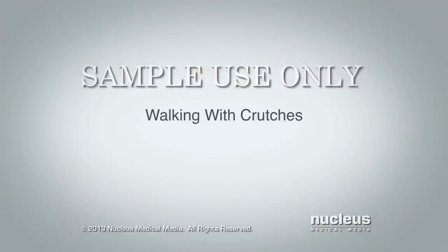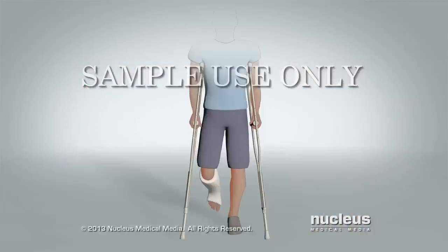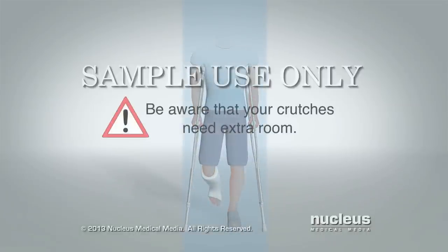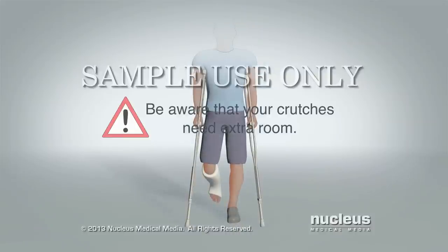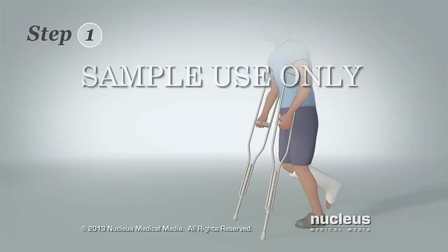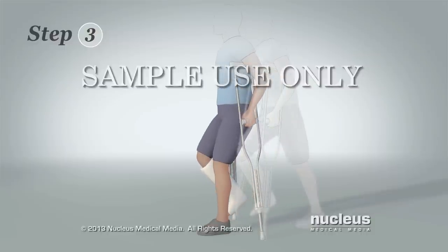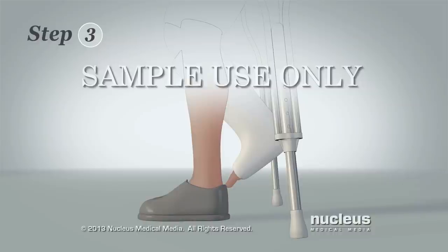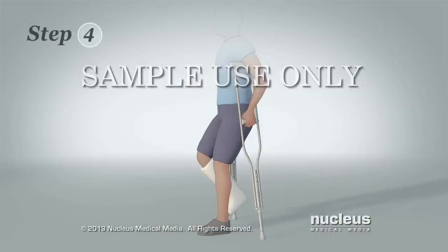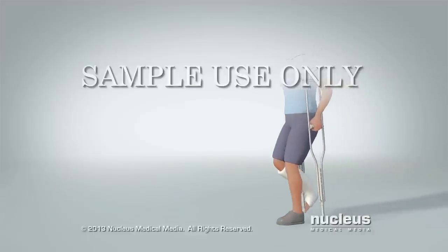Now you'll learn how to walk with crutches. Be sure to look where you're walking — don't just look down at your feet. Also, be aware that when you walk, you will need extra room on either side of your body for your crutches. Step 1: While standing with the crutches, move the crutch tips one step in front of you. Step 2: Put your weight onto the hand grips of your crutches, then swing your injured leg forward. Step 3: Take a step with your uninjured leg, making sure to land level with or just ahead of your crutches. Step 4: Move your crutch tips forward a bit to balance your weight. Repeat the steps to keep walking.